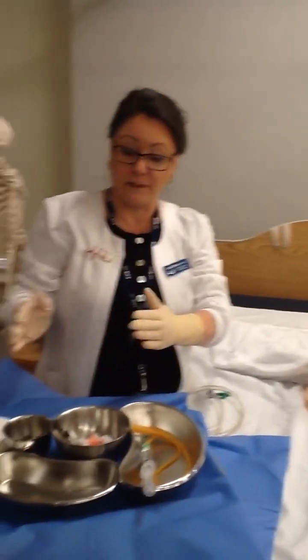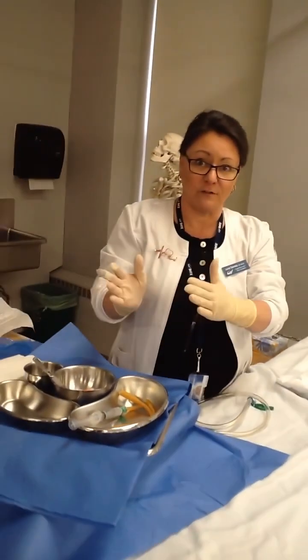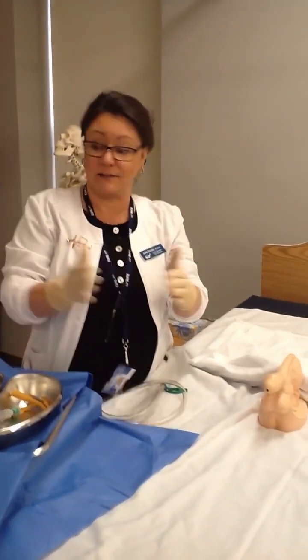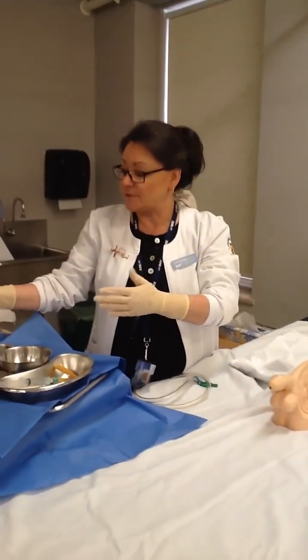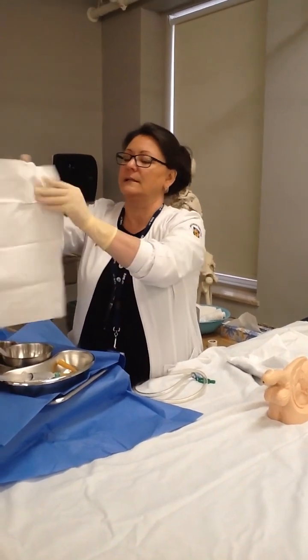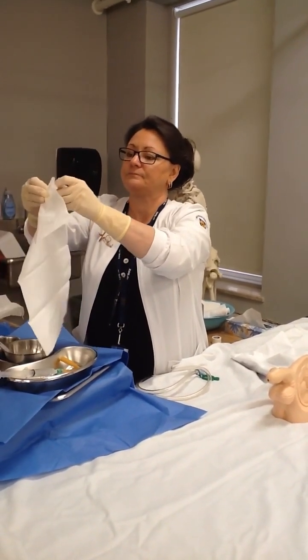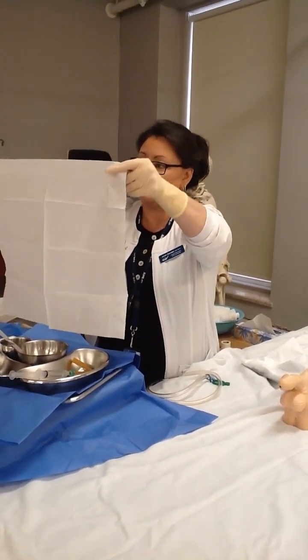So now I'm ready to move my sterile field. Here's my sterile field right now, my first one. My second sterile field, the one I need to insert my catheter, I have to move over here. I do that with these drapes. The first drape I pick up is a solid drape. It's just all solid paper towel. So I'm going to open it up above my tray.